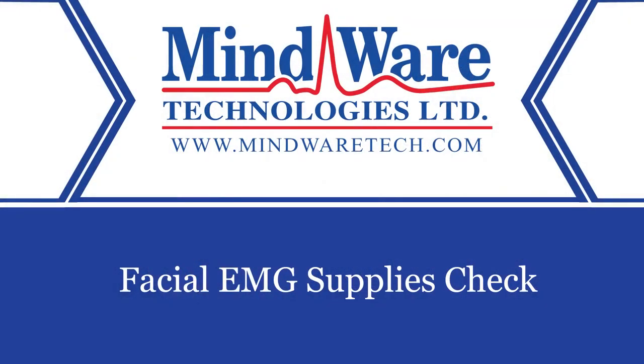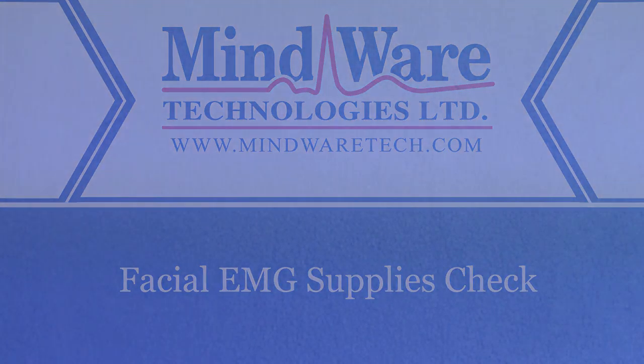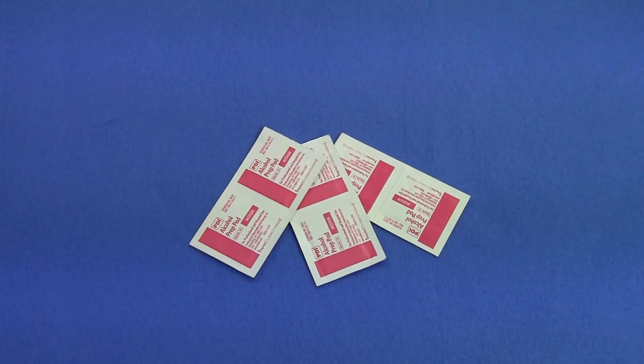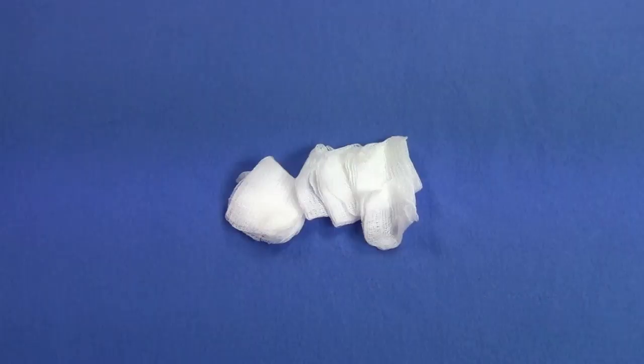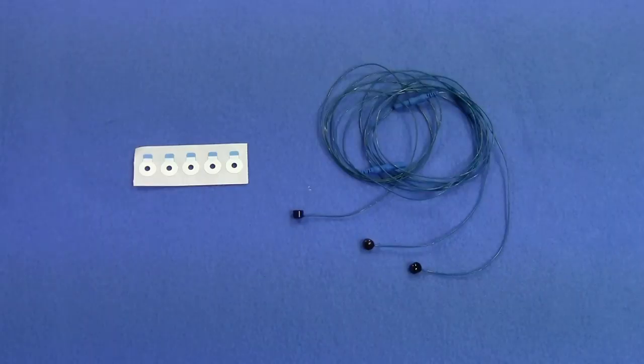The first thing to do in collecting facial EMG is to gather our supplies. To collect facial EMG we need alcohol prep pads to clean the site, abrasive lotion and cotton tip applicators to abrade the electrode site. Be sure to check the expiration date on your abrasive lotion. Gauze to clean the site, adhesive collars and reusable electrodes.